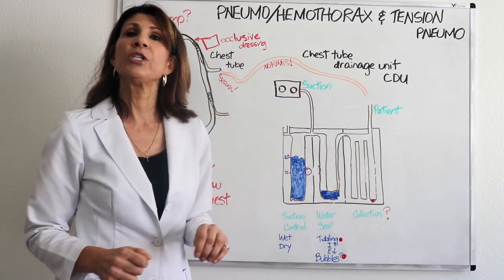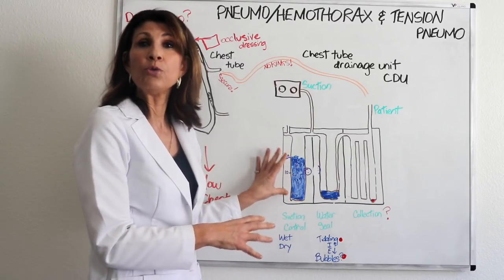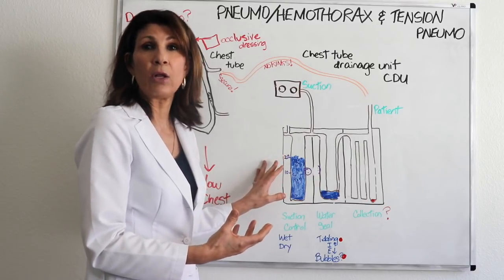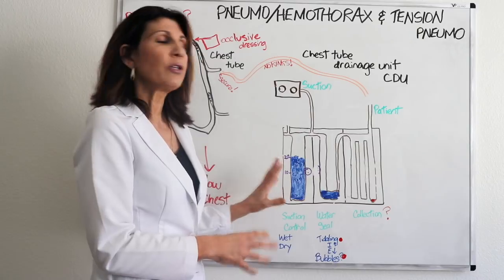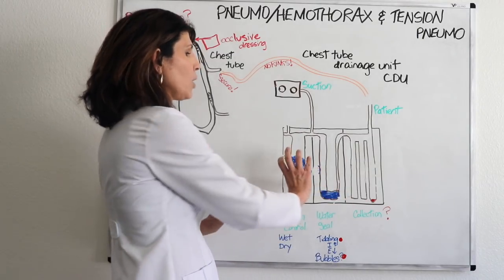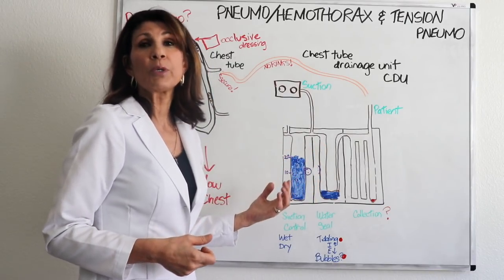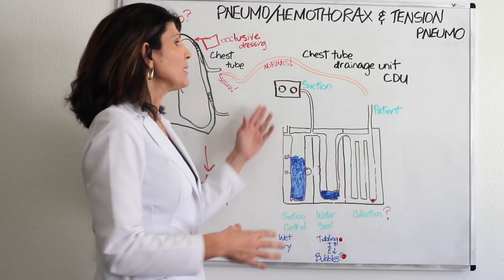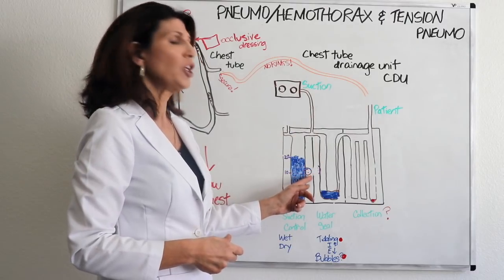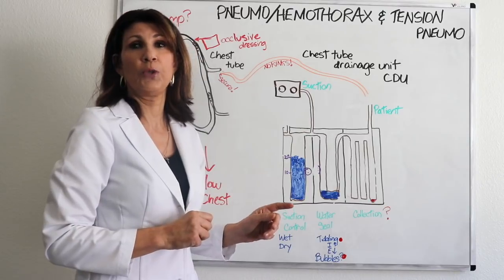Now, there are chest tube drainage units out there that do not use water. It's called dry suction, and that's really just a dial. So the setup is a little easier. It's one less chamber to have to fill up to the line that you're supposed to fill it up to. You dial it to 20 if 20 is what's prescribed, and then it's the same idea. It doesn't matter how high up this suction goes, you will still have whatever the dial is turned to.